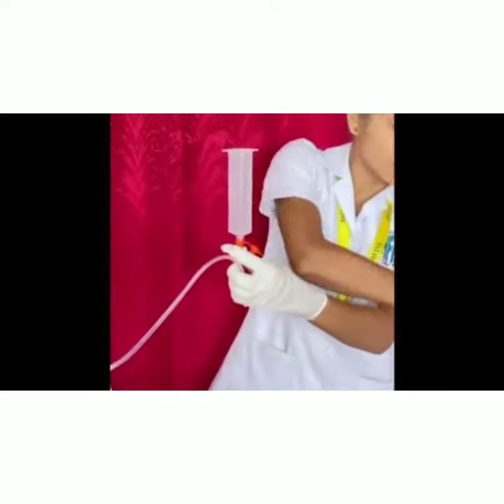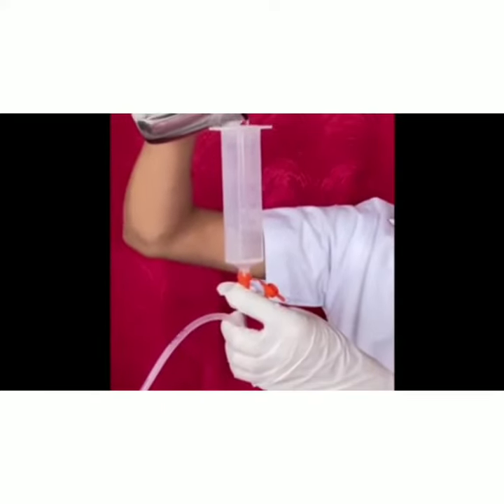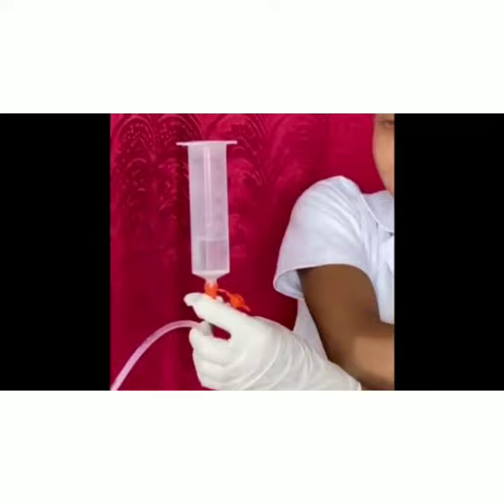Fill the syringe barrel with water and allow the fluid to flow in by gravity by raising the barrel above the level of the patient's head.